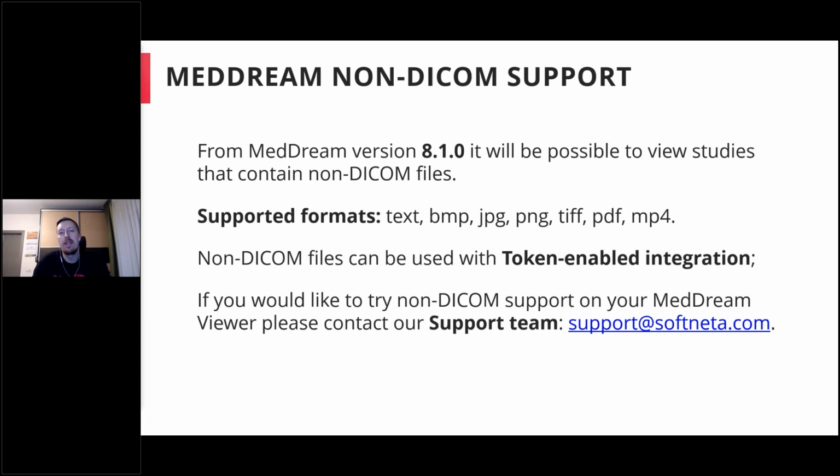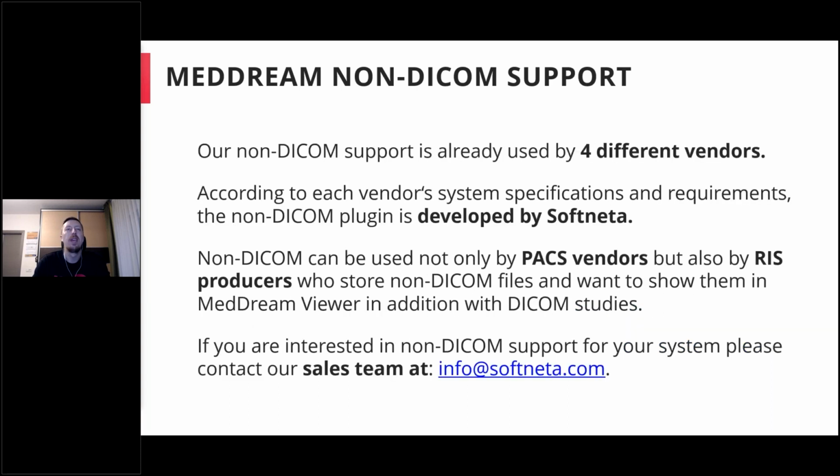So once this new version is released, and if you would like to try this non-DICOM support, you can always contact our support team, and they will help you to set up everything. They will explain how to do it and how to test it. And of course, in a minute, I will show you how it works.